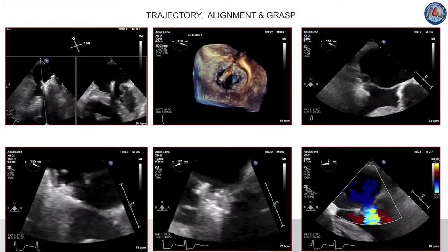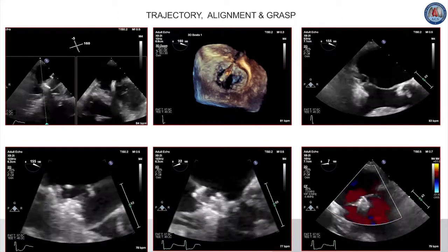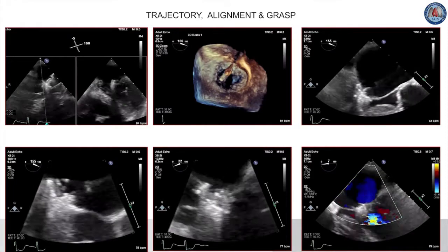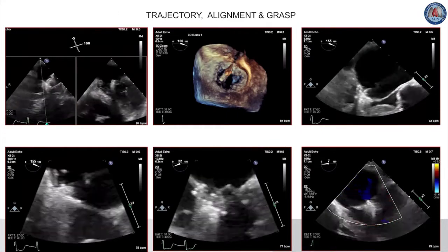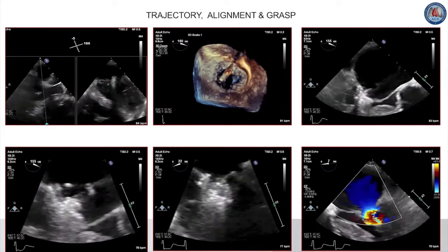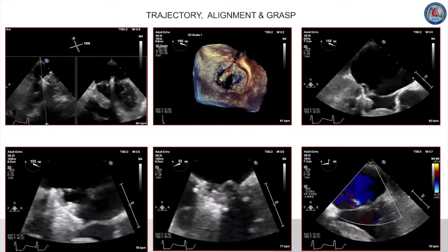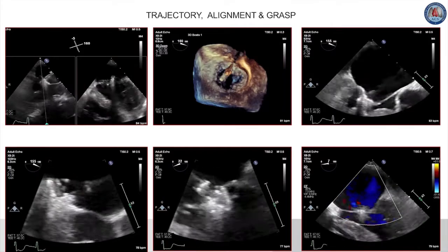After that, the mitral clip is directed into the left ventricle and then pulled back up towards the mitral valve. This is for the grasp to be performed. The mitral valve leaflet tips should be buried into the recesses of the mitral clip and should be resting over the clip arms. When that is confirmed, the grippers are lowered, and after the grippers are lowered, the gripper bounce is one way to check to see that the mitral leaflets are buried between the grippers and the clip arms.